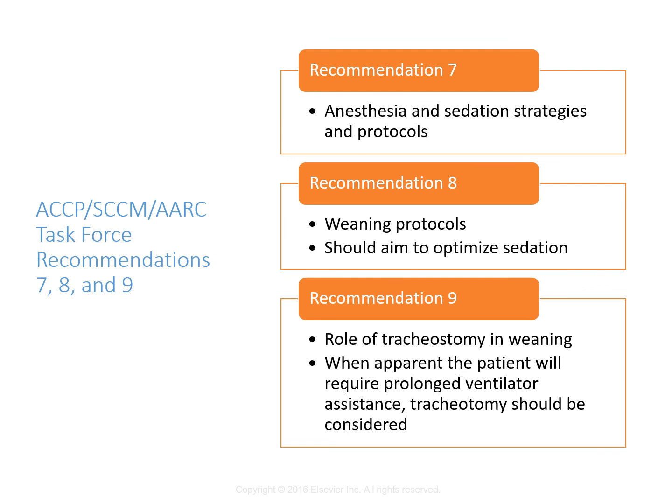So vent modes that guarantee a certain breathing rate, like CMV modes or even IMV or MMV that we just talked about a little bit ago, are important with unreliable respiratory drives. So the immediate postoperative patient may be ideally suited for those simple automatic feedback modes that we talked about before as a form of support. So MMV or volume support might be good for those patients.